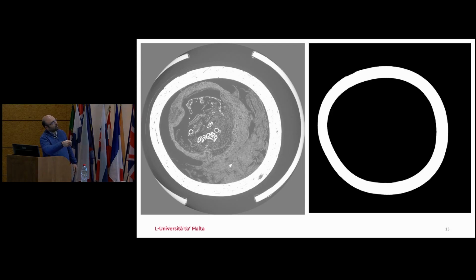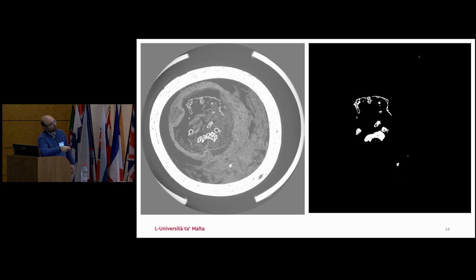And this is what the computer says, right? So this is not, a human didn't do this, the computer did, based on the information that it learned from the previous slice. If we see then, for example, something more interesting like bone, this is also what the computer thinks is bone, based on what the previous slice it found.